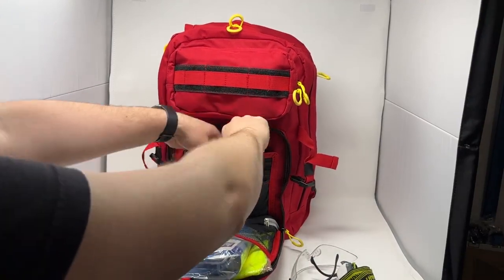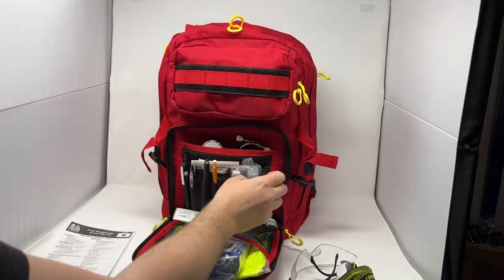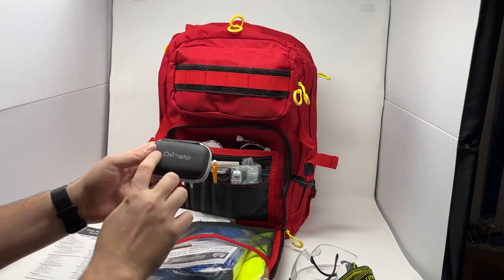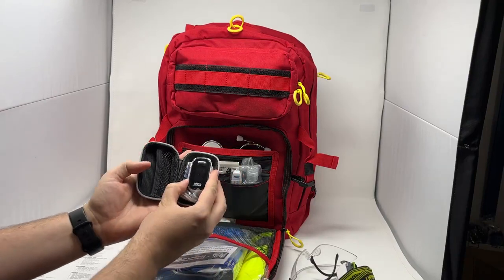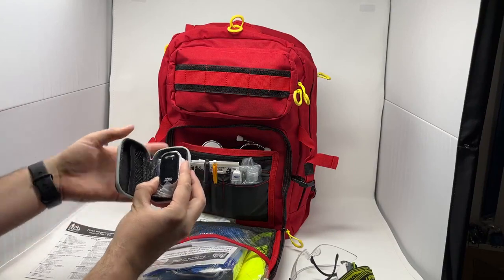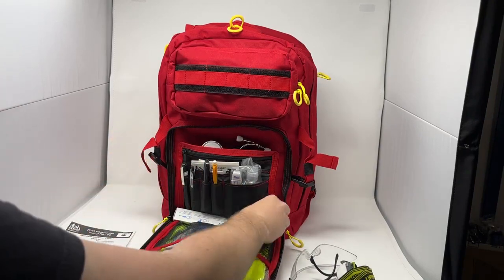We have a stethoscope for listening to lungs, bowel sounds, anything else you need to auscultate. Then we have our brand new oximeter in a hard, rigid, clearly labeled oximeter case. It's a nice zipper case that comes with the brand new Physiologic oximeter, which is one of the best on the market right now. It's a Health Canada-approved oximeter and comes with your batteries and a lanyard as well, for checking oxygen levels with your patient.